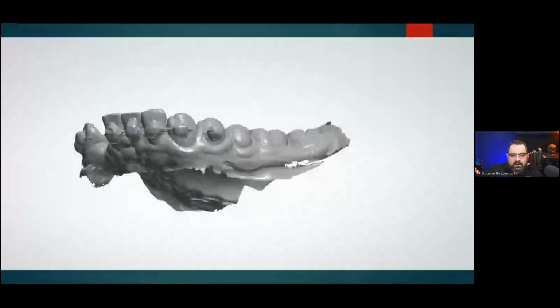Okay. And before I move forward, I want to take a look at the questions that you guys have. So there's 10 questions. How often do you change bulbs in the curing unit? With this curing unit, I haven't changed the bulbs at all, and these are all encapsulated. I'm not sure if you need to change those out, but over time, obviously, everything breaks. So that's something I would reach out to Acuretta and ask them.